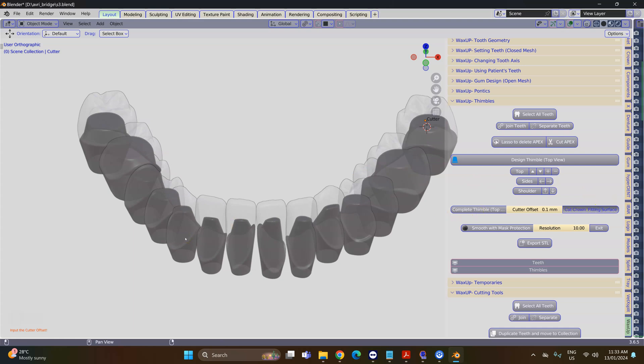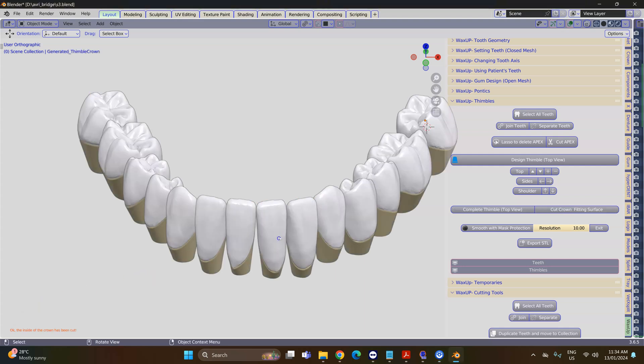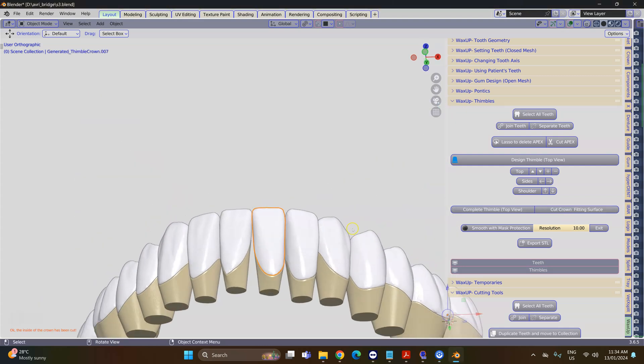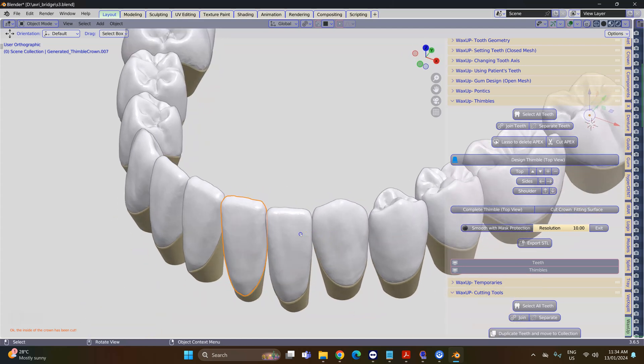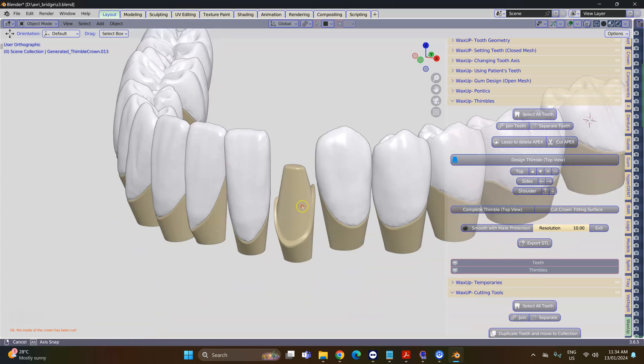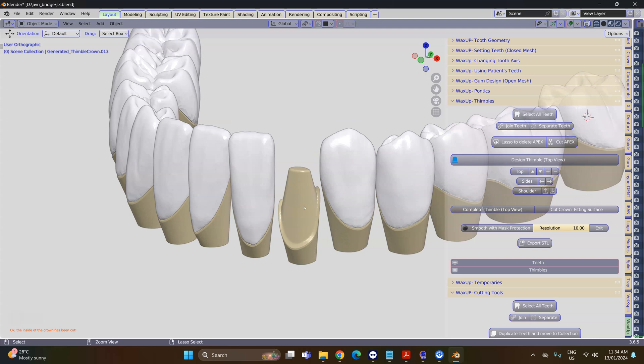Here I'm going to cut the crown fitting surface. This is going to separate out the crowns and will then create these objects—you've got the crown and you've got the thimble underneath.